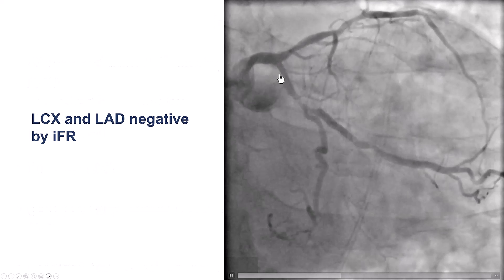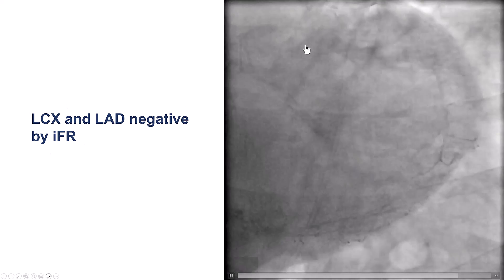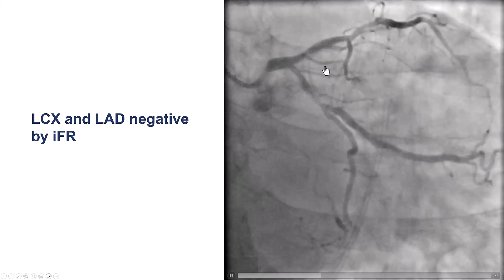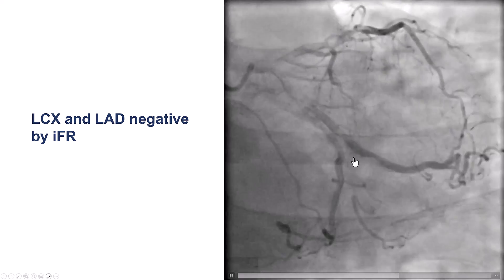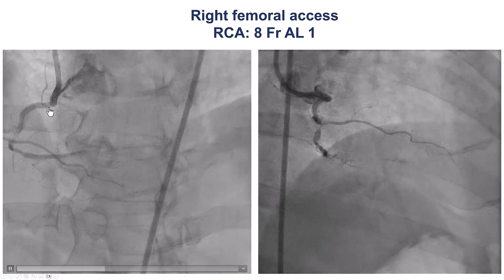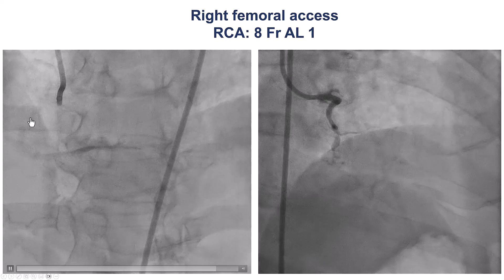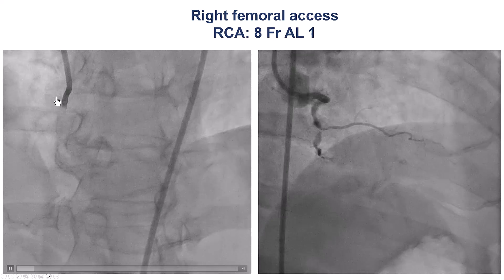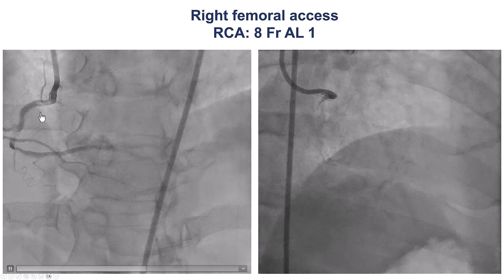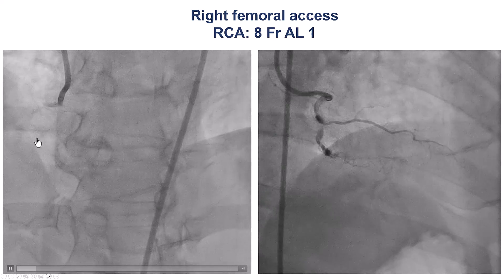The left system was assessed using physiology and there were no significant hemodynamic lesions despite the angiographic intermediate lesions. This is the right coronary artery. When the patient came to us, we had an 8 French AL 1 guide which helps tackling complex lesions, and this is indeed a very complex lesion.